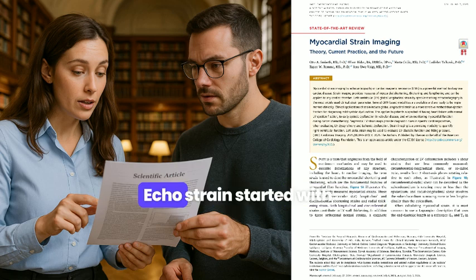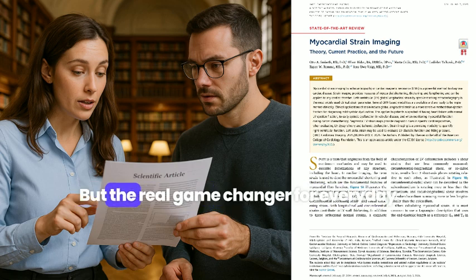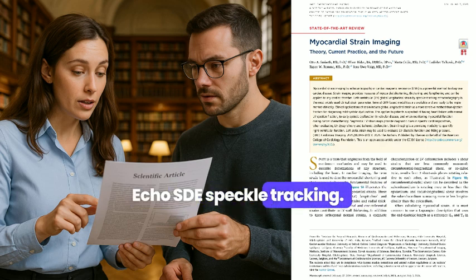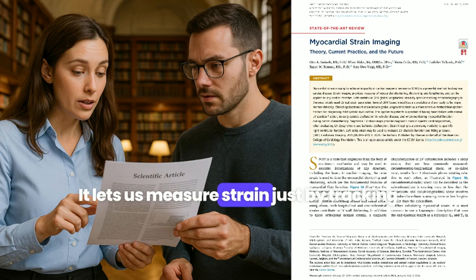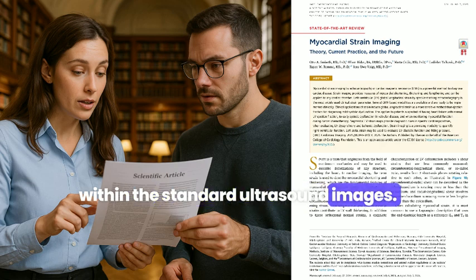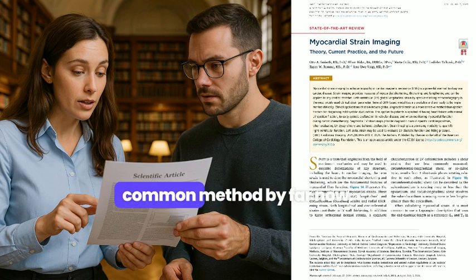Ultrasound. Right. Echo strain started with 1D tissue Doppler imaging. Yeah. But the real game changer for everyday clinical use was 2D speckle tracking echo, STE. Speckle tracking. Yeah. It lets us measure strain just by tracking these natural patterns, these speckles, within the standard ultrasound images. It's become the most common method by far now.